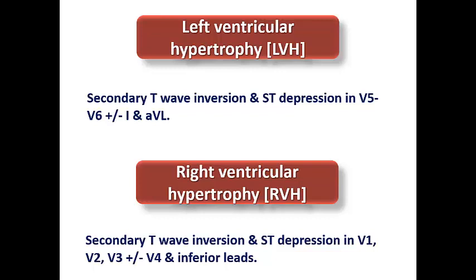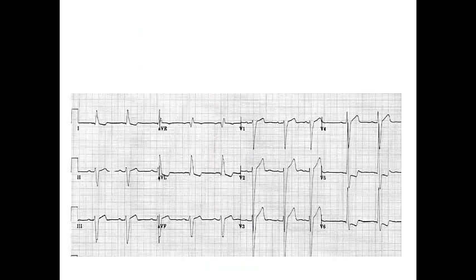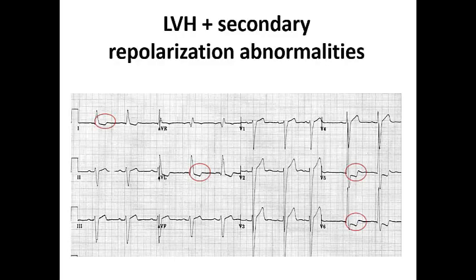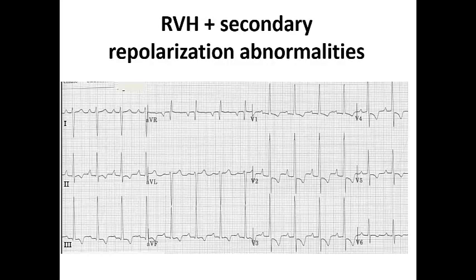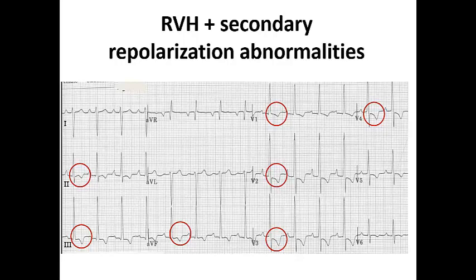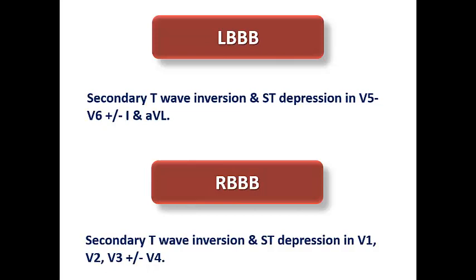In LVH, secondary T wave inversion and ST depression usually occur in V5, V6, and lateral leads (I, AVL), whereas in RVH they usually occur in right precordial leads V1, V2, V3, sometimes V4, and may extend to inferior leads. Here we can see the voltage criteria of LVH with T wave inversion and ST segment depression in I, AVL, V5, and V6 — this is LVH with secondary repolarization abnormality, or LVH with strain pattern. In another example, the patient has ST depression and T wave inversion from V1 to V4 plus inferior leads — RVH with strain pattern.